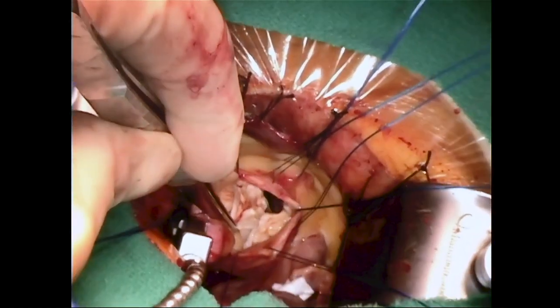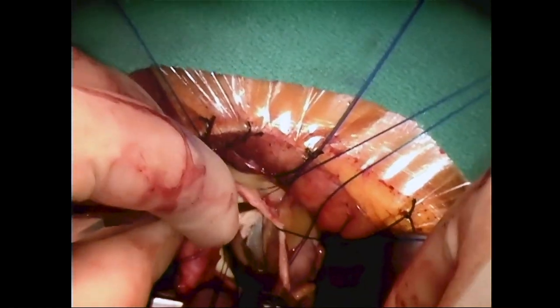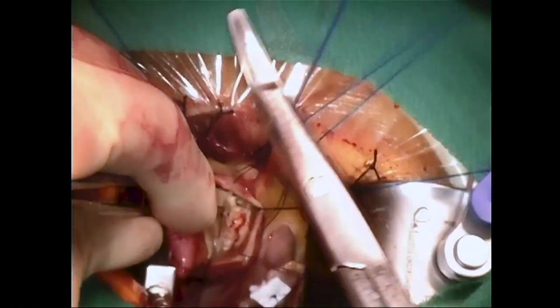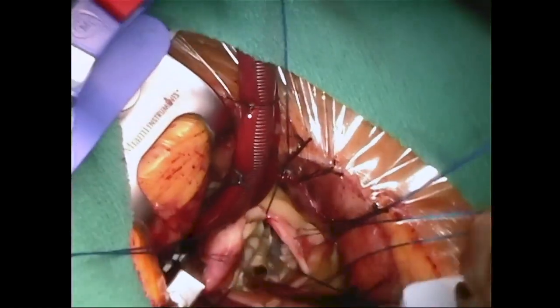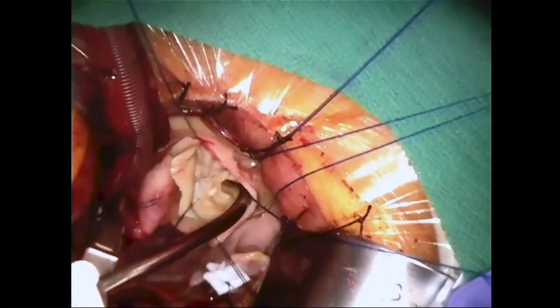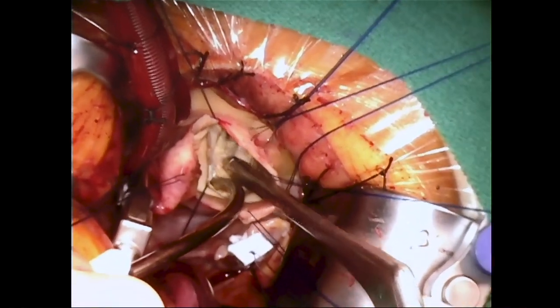The aortic valve is now exposed, and the exposure seen here is typical of most cases. The rest of the operation proceeds in standard fashion. This is a heavily calcified aortic valve that is excised and the annulus is carefully debrided as usual.